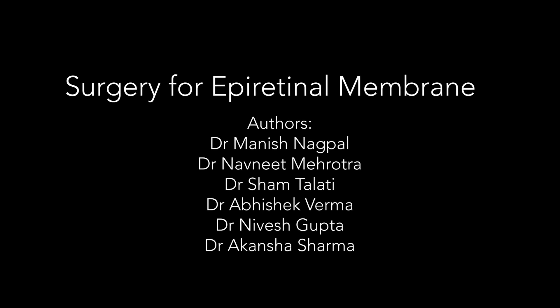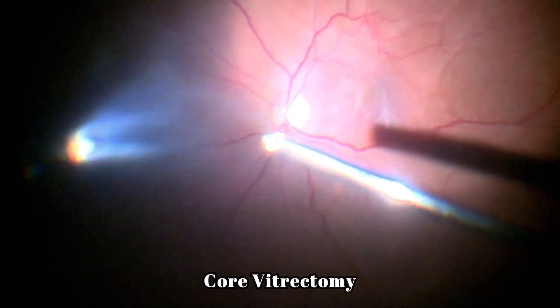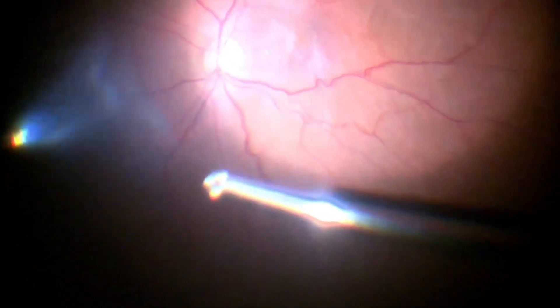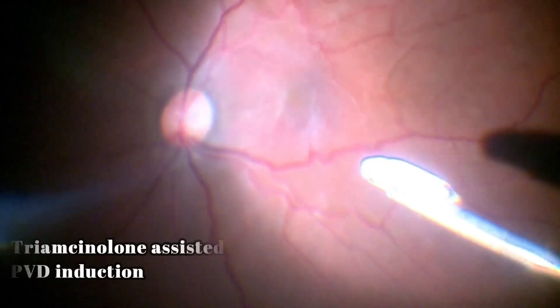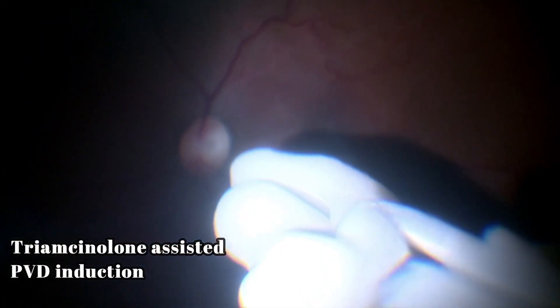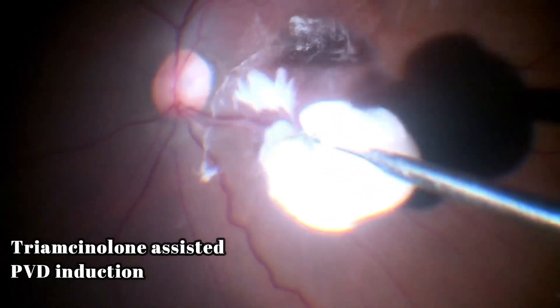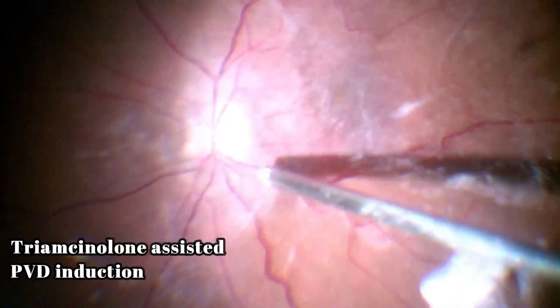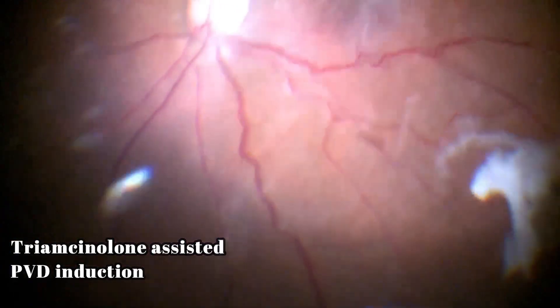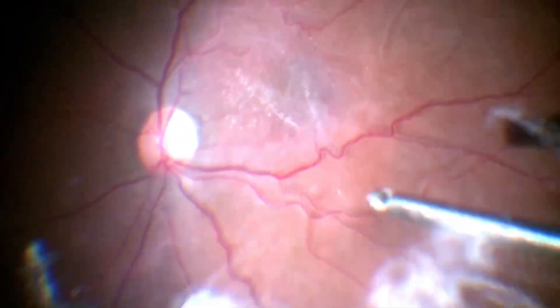This video discusses surgery for a variety of epiretinal membranes. In this case of an idiopathic membrane, vitrectomy is being done. Once vitreous is cleared, triamcinolone is injected to facilitate PVD induction. The residual triamcinolone is removed and the hyaloid is detached from the retina.